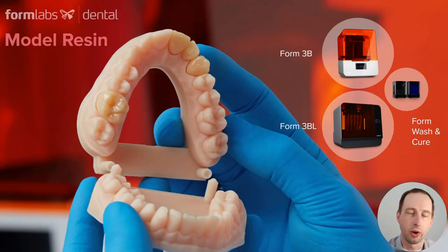Model resin works on our SLA 3D printers. That includes the Form 3, 3B, Form 3L, and Form 3BL, and of course it works with our existing post-processing solutions, Form Wash and Form Cure.